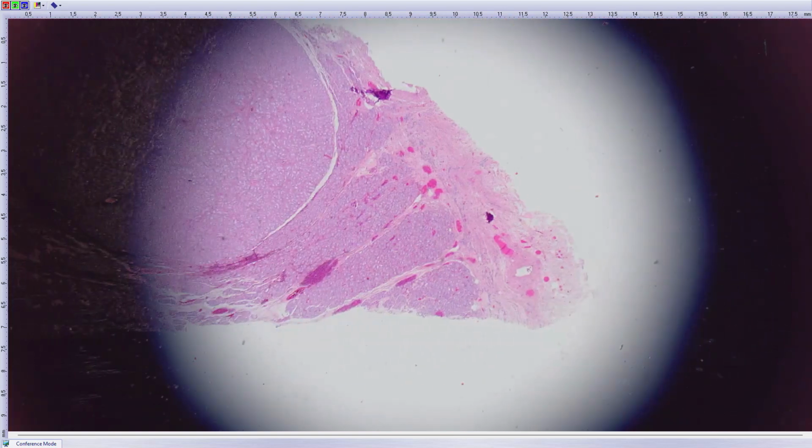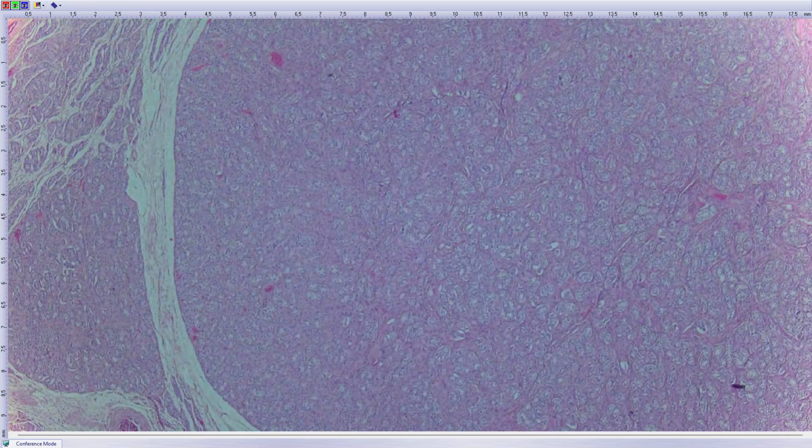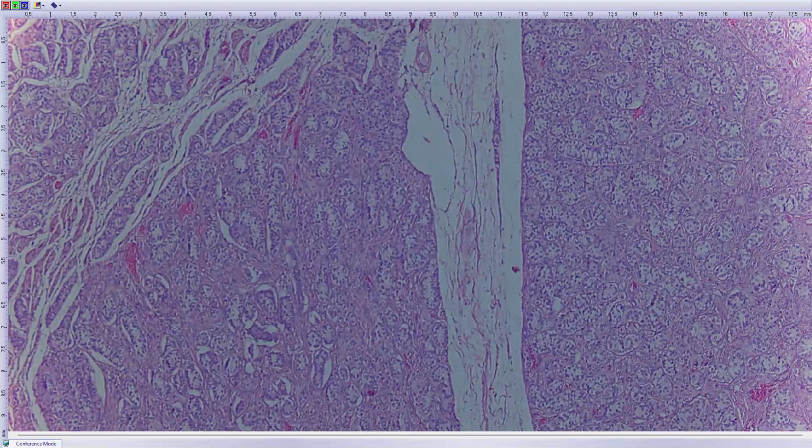Another biopsy is from a girl, born 2007, so a young woman, and they took out both gonads. This is one of them. She has a girlish name, and she was regarded as a girl, but regarding her karyotype, which is 46,XY, she's not a girl. She's a boy with androgen insensitivity syndrome, which means that she was born as a boy having a Y chromosome, but there is no sensitivity of peripheral tissues to androgens.